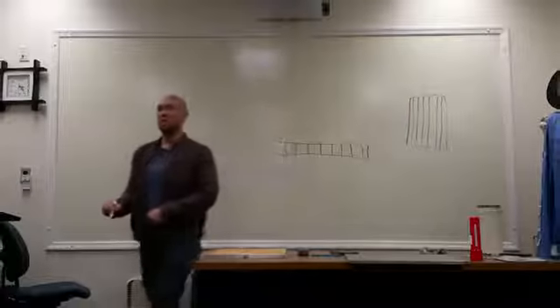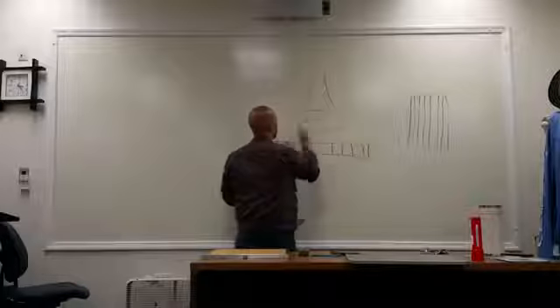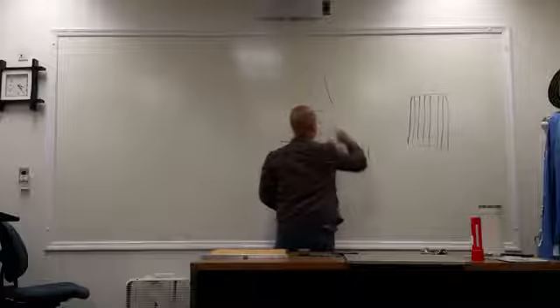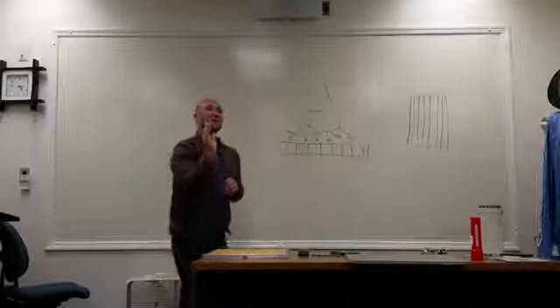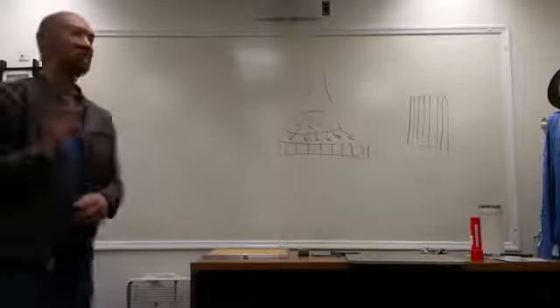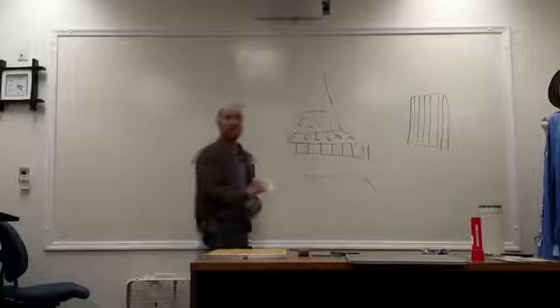Okay? Now, as we know, here's your patient's body, here's your primary beam. Scatter radiation is going to go in all different directions. The purpose of the grid is to allow the more straight traveling scatter radiation and primary beam to reach our film.